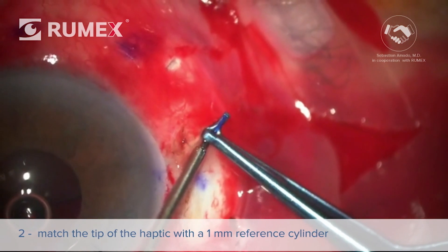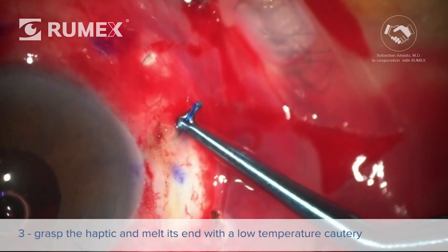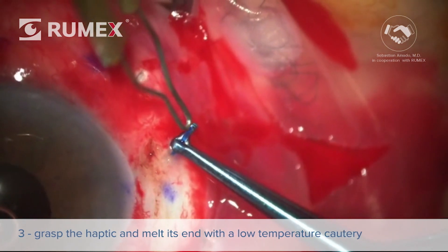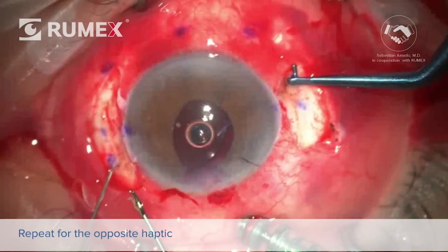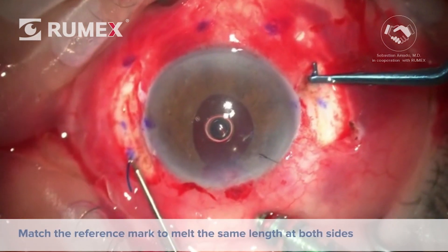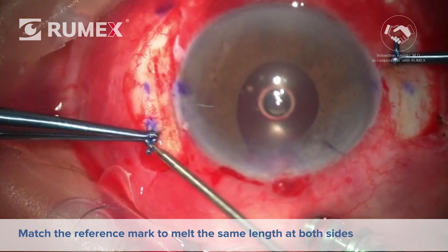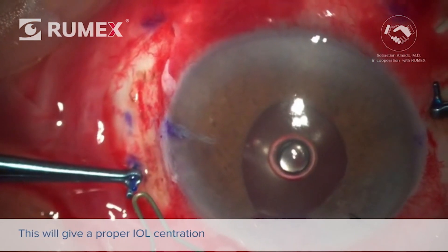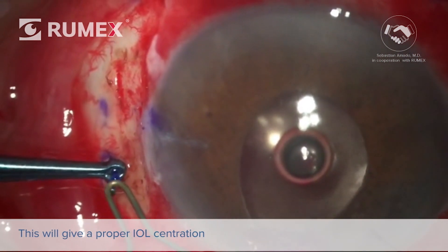The second step is to match the tip of the haptic with the 1 mm reference cylinder. The third step consists of firmly grasping the haptic while approaching a low-temp cautery and melting the haptic end. The process is repeated for the opposite leading haptic. Be always careful to match the reference mark in order to melt the same length of haptic at both sides. This will more likely give a proper IOL centration, assuming that the scleral tunnels have been well constructed.